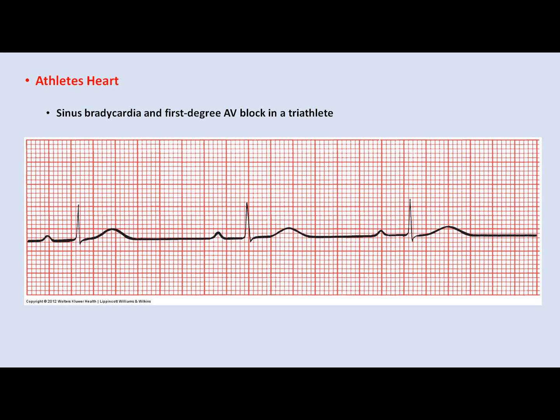Athlete's heart, we talked about that, like Dr. Nia Lizilvas. His heart rate is low, and look how slow this is. It's very slow, about 38. And he's fine because his heart is well conditioned. But if I had it, I'd be on the floor by now.